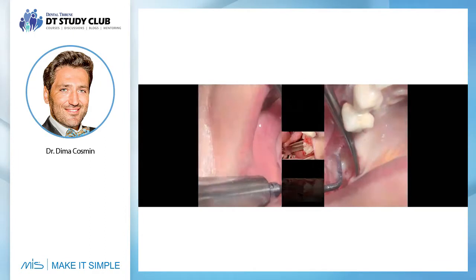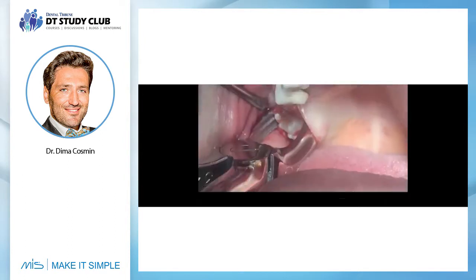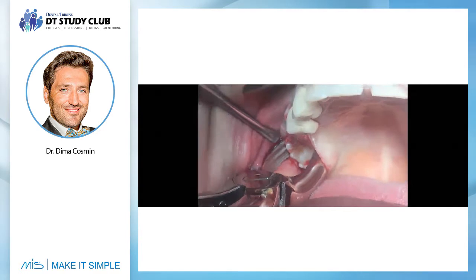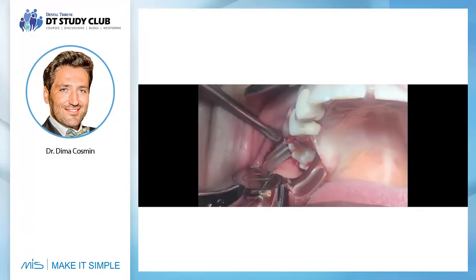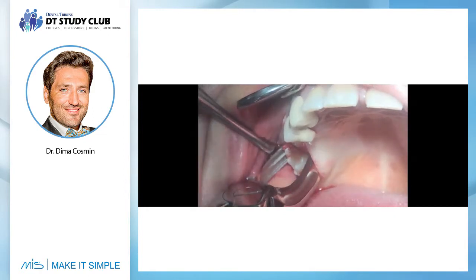These are the tips used for extracting the tooth. And after that, with the forceps, it is easier. This is in real time.